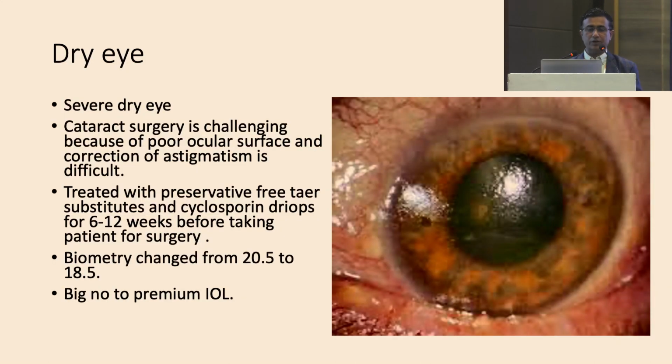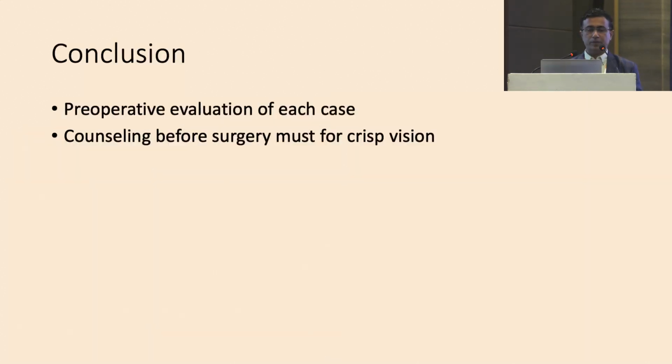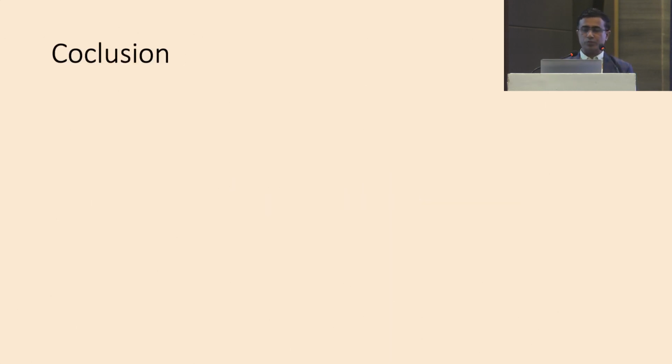Another patient having dry eye, with the same problem: the biometry changed from 20.5 to 18.5 diopter because of treatment for dry eye. So big no to premium IOL if the patient has got severe dry eye. So, conclusion: preoperative evaluation is very important in each and every case, and counseling before cataract surgery is a must for crisp and clear vision. Thanks for your patience in listening.